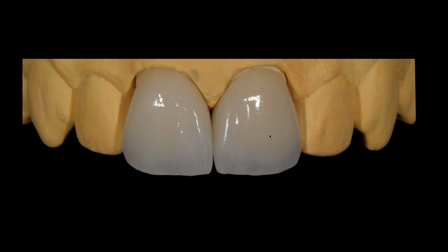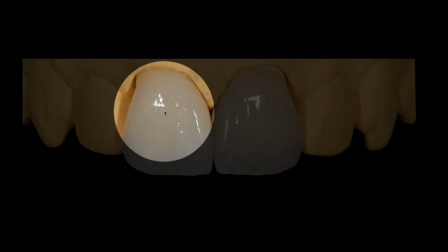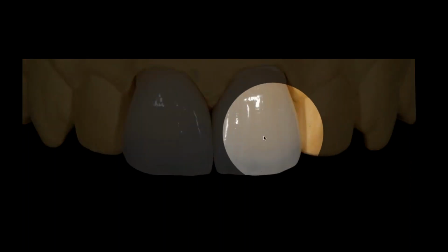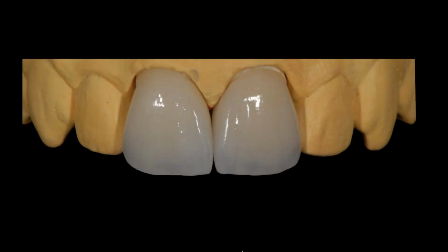Now what I want you to notice, I've flipped these over, so I hope you don't get too confused. I should flip the other ones around. The number 8 is the one that has the opacious dentin materials behind it, and the number 9 is just the A1 dentin and 1 enamel. And I want you to look at those 2 teeth carefully, because I could tell you sometimes untrained eyes look at it and say, well, I like the 9 better. Do you? And the reason you usually do is because it looks more translucent to you.